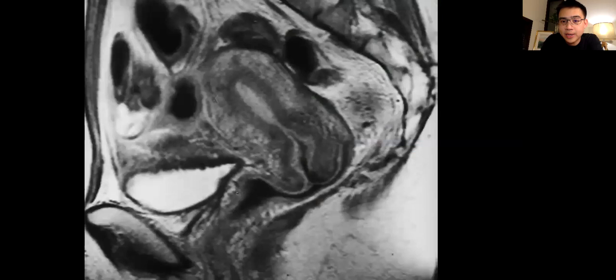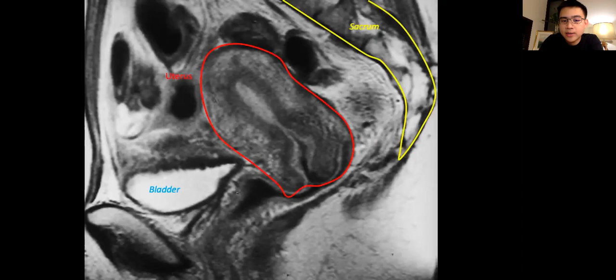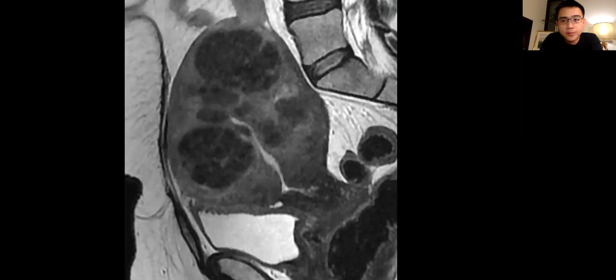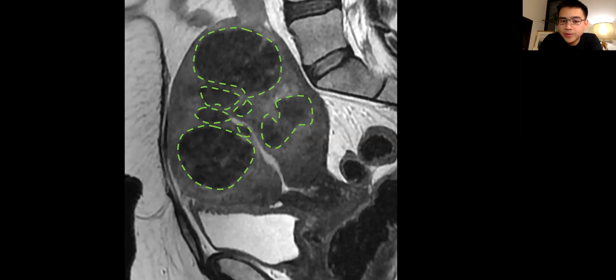This is an example of an MRI image taken sagittally, or from the side of the patient. You can see the bladder in front, the spine or sacrum behind, and the uterus in the middle. Other pelvic organs such as bowel and pelvic fat are also clearly seen. This MRI done for pre-treatment planning shows multiple fibroids in the uterus. MRI is useful for complicated cases where fibroids are multiple or extremely large, giving a good idea of location, sizes, and relations of the fibroids.